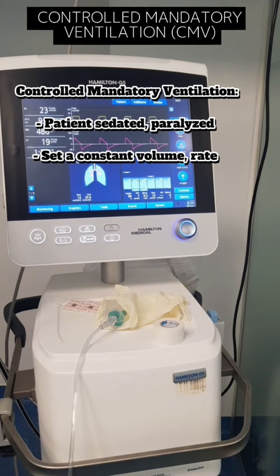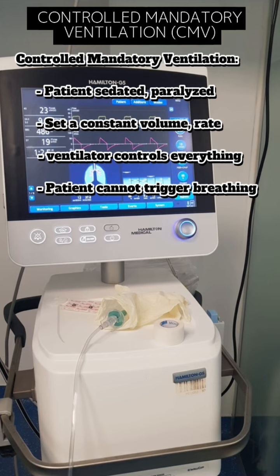All the breaths are provided by the ventilator in CMV mode. There is no effort of the patient in breathing. The patient is sedated, paralyzed, and the ventilator takes control of the patient's breathing. We can set a constant volume, constant rate. Pressure is to be decided by the ventilator, as we have discussed earlier. Ventilator controls everything. Patient cannot trigger breathing.